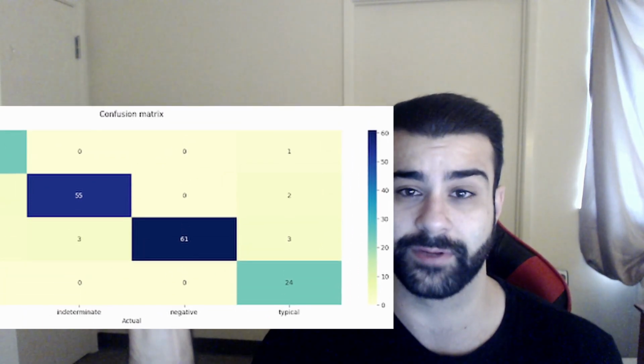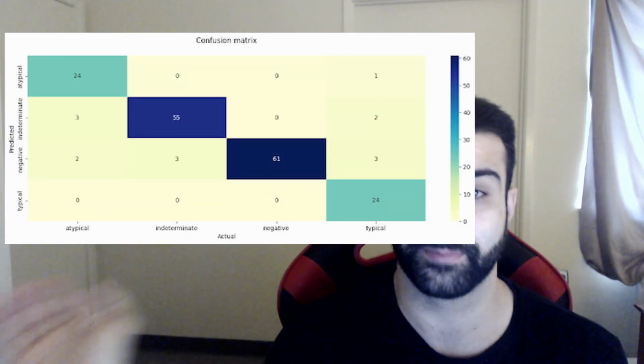After I had developed a script that would run our model through and find the best combination of those dense layer units, we ended up with a validation accuracy of 92% and training accuracy of 96%, which is exactly what we were looking for in the scope of time that we had. We ended up with a very impressive confusion matrix, and we were very proud, as a group, of what we had accomplished.